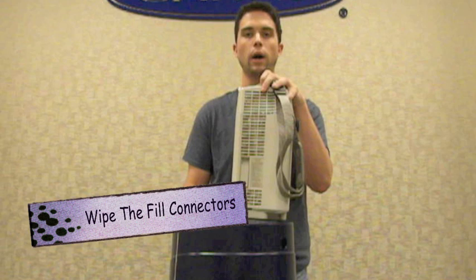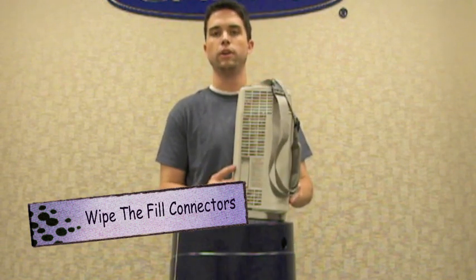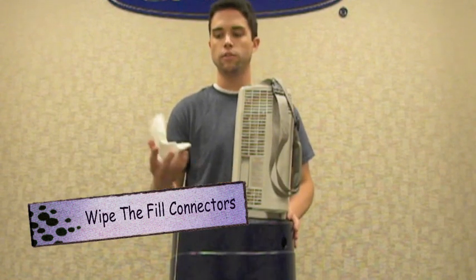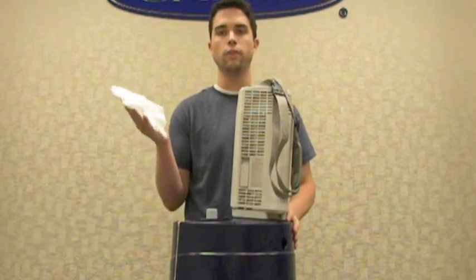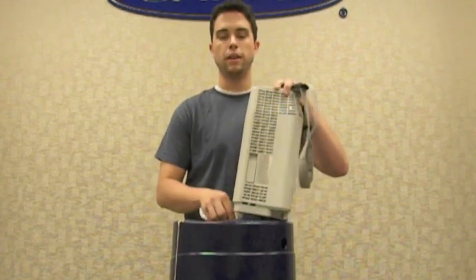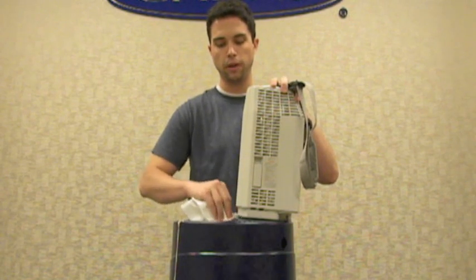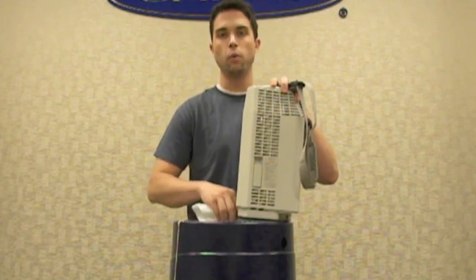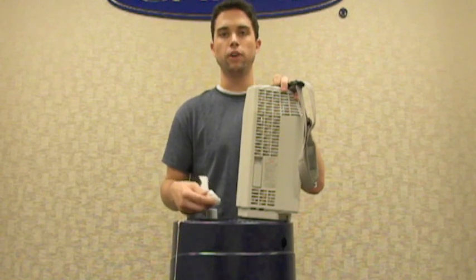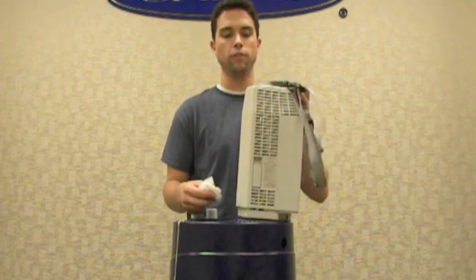First thing you want to do is wipe your fill connectors off — both the blue fill connector on the reservoir and the blue fill connector on your companion unit. Start with the reservoir. Use a clean and dry lint-free cloth and wipe off very gently. Be careful not to apply downward force to disturb the poppet in the center. Removing all this moisture is important because if you get moisture on the fill connectors, as you start filling, that can freeze and cause leaks after the fill.